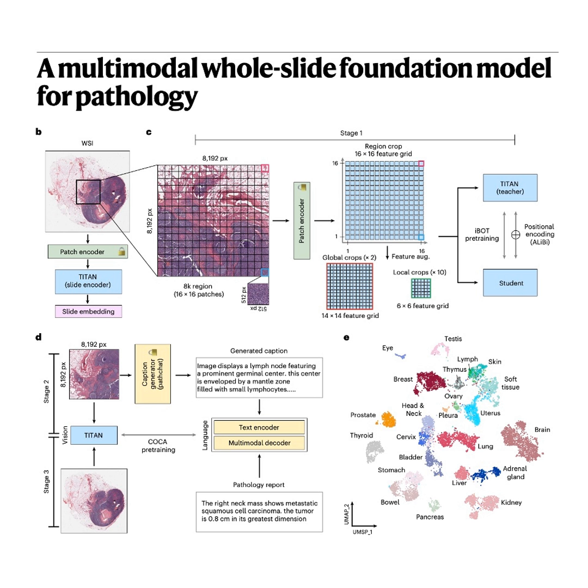Okay, finally, let's talk about the clinical utility of rare cancer retrieval. This sounds incredibly important. It is. When a pathologist faces a complex or rare case, the gold standard is to retrieve similar historical cases, both the slides and the reports, from the hospital's archive for comparison. So it's like having instant access to decades of institutional knowledge, indexed not just by text, but by what the tissue actually looks like under a microscope.